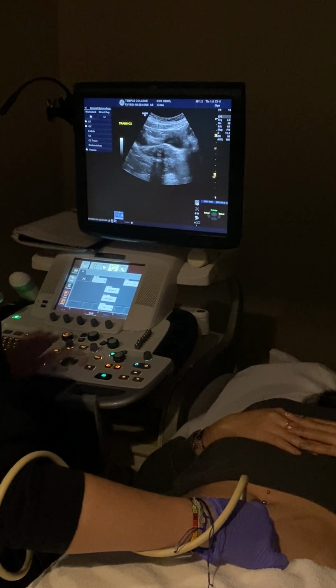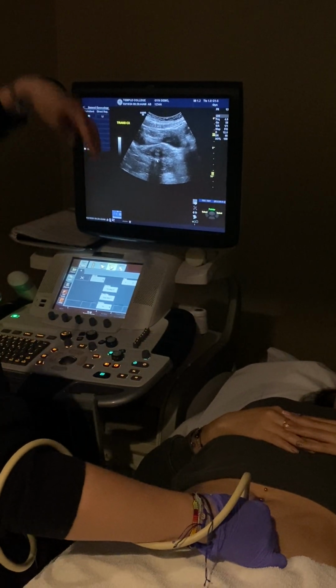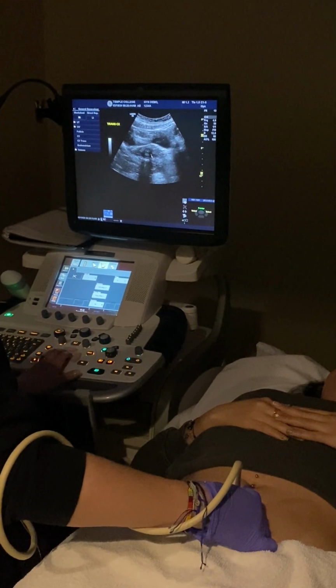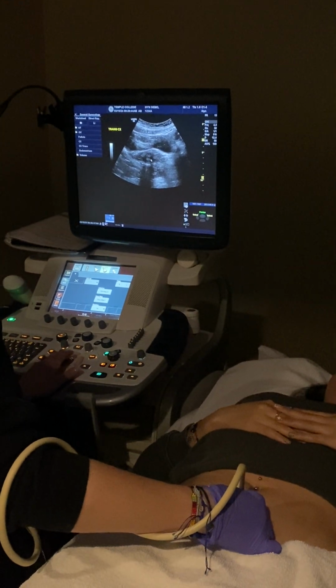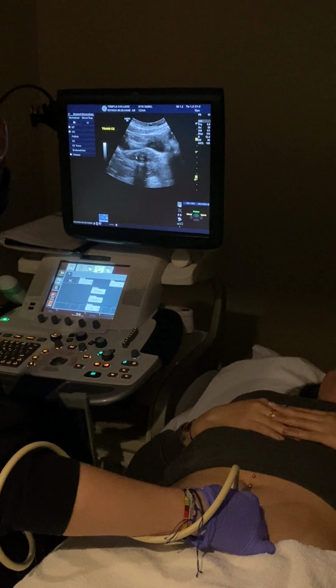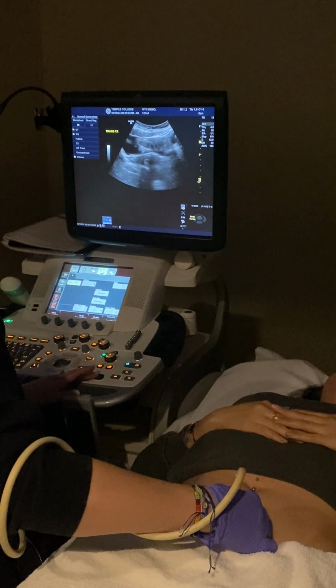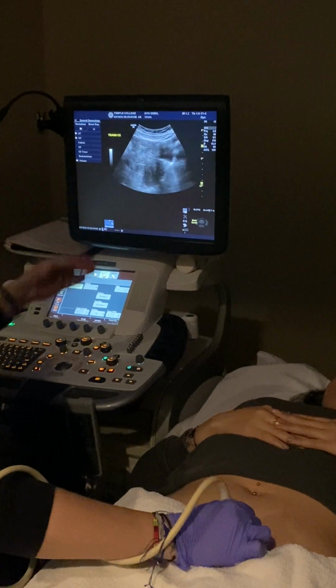And I'll tell you, with her cervix, you've got these shadows coming down either side, the fornix on the side of the cervix. They create those shadows when you're in trans. So this is kind of like one of those little clues that you're in the right spot. And you're going to have this circular, donut shape to the cervix. Okay? Now because she is retroverted, that means her uterus points towards her back.